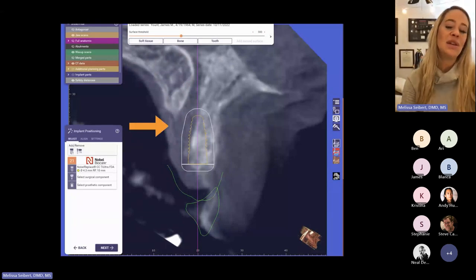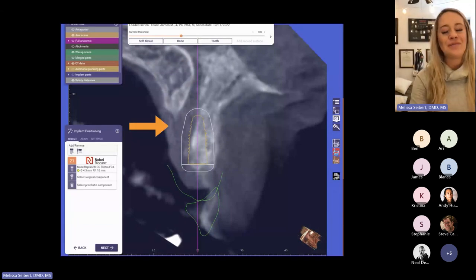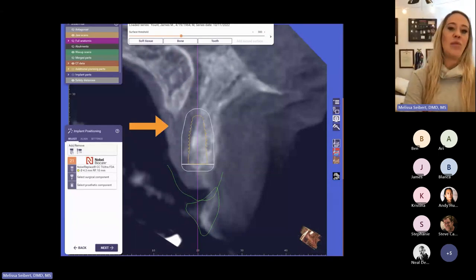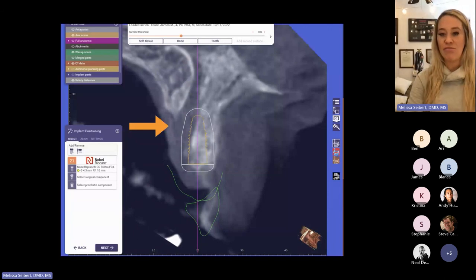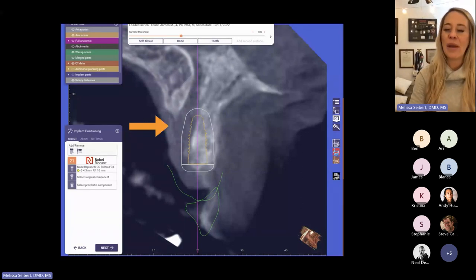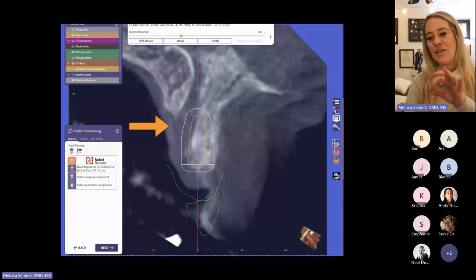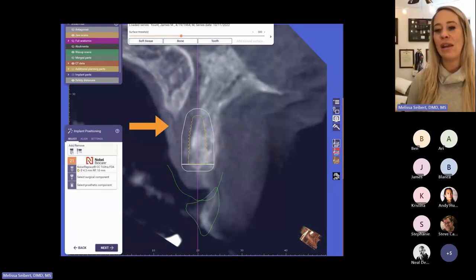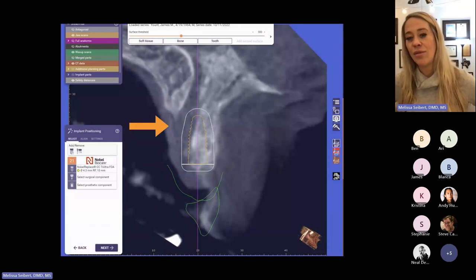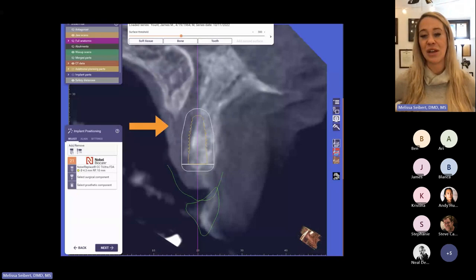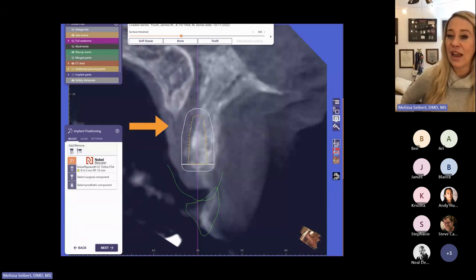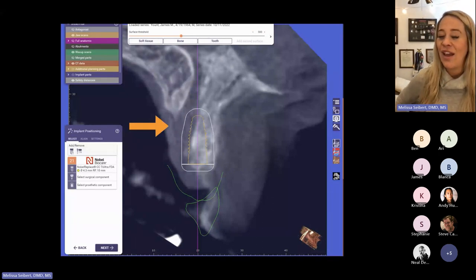That's a bit of a concern for me, just because I'm not going to have the same sort of stability that I want. In this case, am I necessarily worried about a paresthesia? Not really. In fact, people will place implants in this zone all the time — you just need to inform the patient that they're going to have some paresthesia in the anterior-most part of their palate, and patients don't really complain about that. What's also helpful about this feature is that you can see the implant in orange, with an outer boundary in white telling you the definitive limits — helpful for avoiding impingement on a tooth or an adjacent implant. Through this process, I was able to have an informed conversation with the patient that we're going to want to nucleate part of that nerve and actually place a graft.